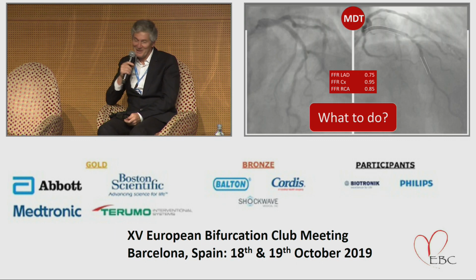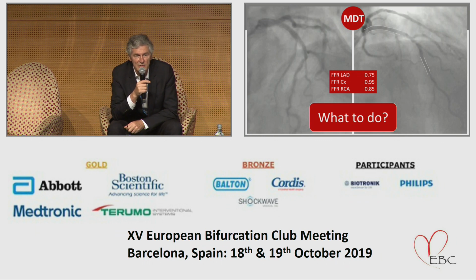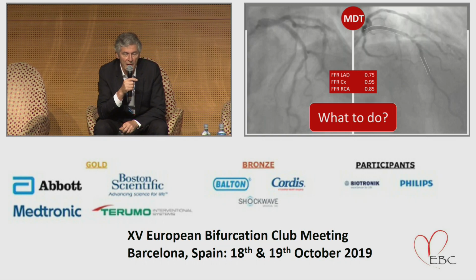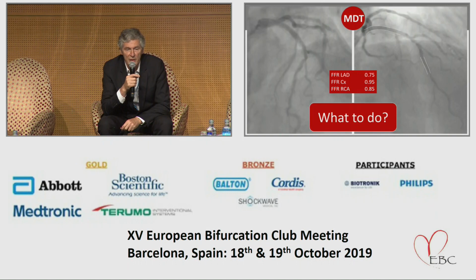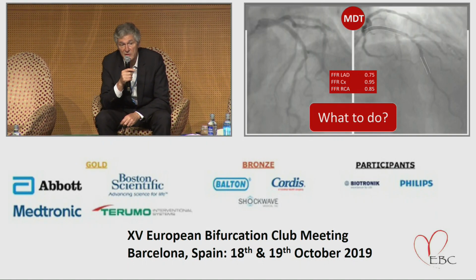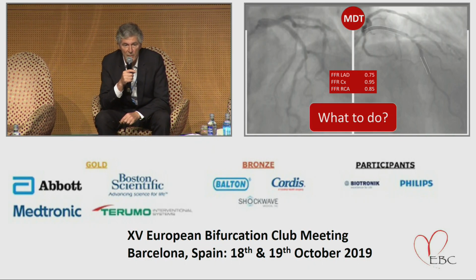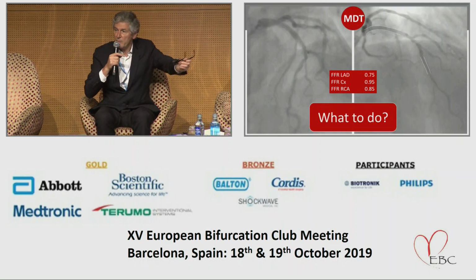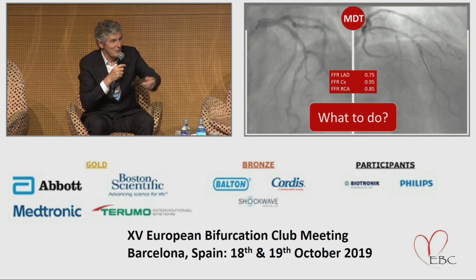Yeah. Maybe, okay. No, I think to come back to this, you have a significant lesion as confirmed by FFR, so you have to treat this lesion. And personally, I will do a provisional approach in this LAD, adding a stent with a provisional approach for the diagonal branch. But we can ask the panel. We have a big panel in here, so who has any comment? Goran, you are part of the panel.